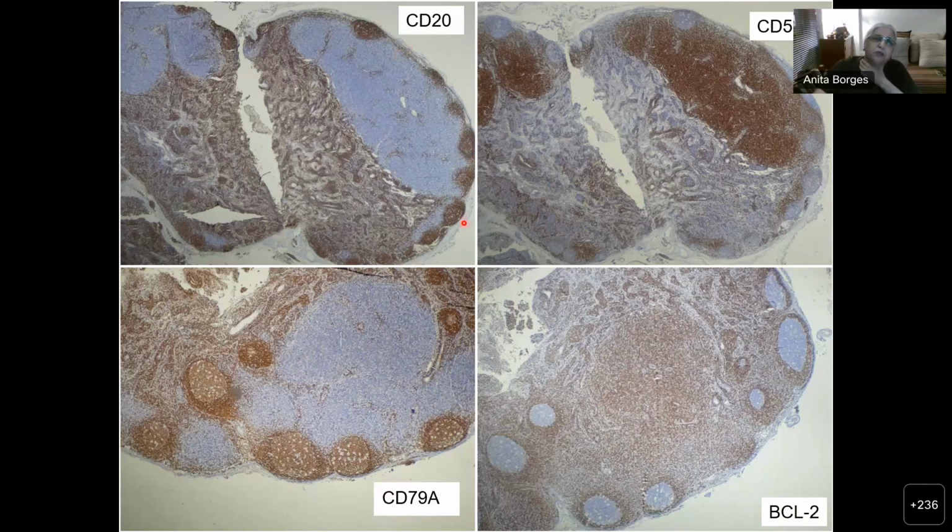That's the cortex, and a completely unstained area in the CD20, which is your paracortex. And then you have this medulla, where you will probably have some B cells and plasma cells. Sometimes plasma cells, very rarely, might even pick up CD20 if it's a heavy stain. Abnormal plasma cells do that all the time.